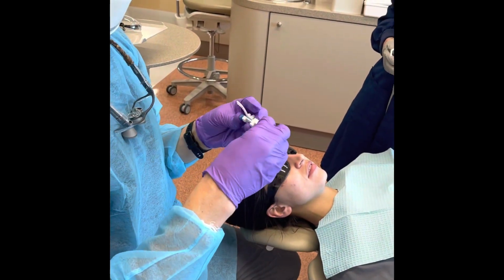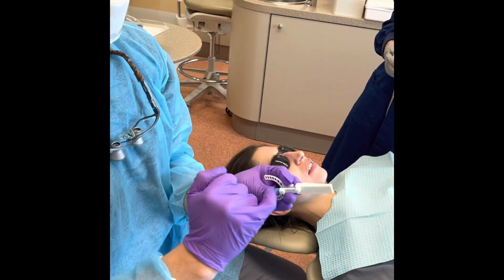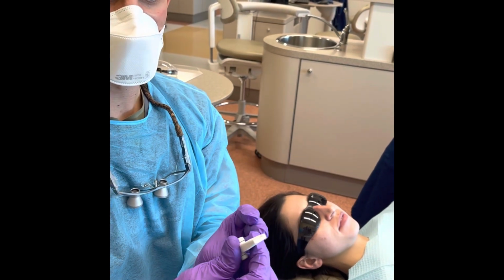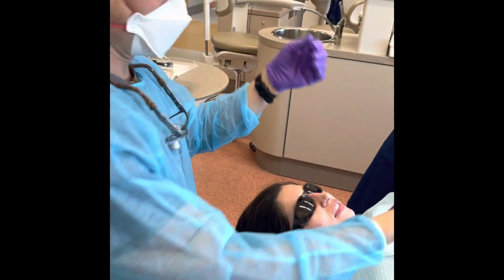Okay. We're going to lock in the lower incisors. Now, if I was doing this with PVS, I'd actually put a little PVS down here to get a more accurate and reproducible lower incisor position. All I'm capturing for this is just her protrusive record, okay?